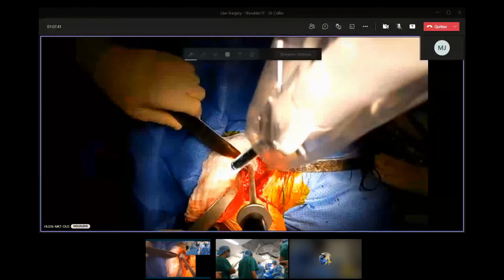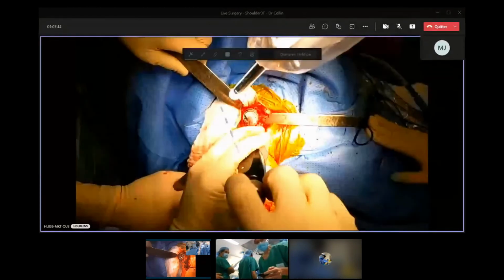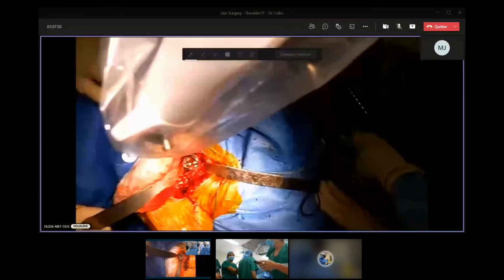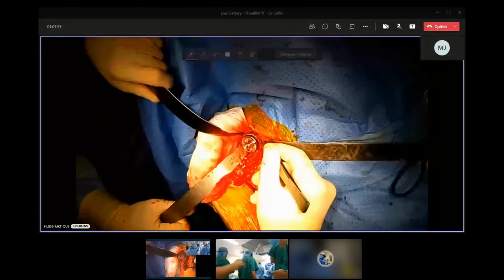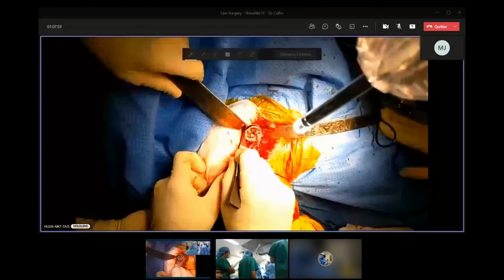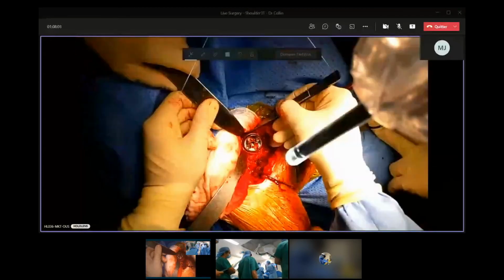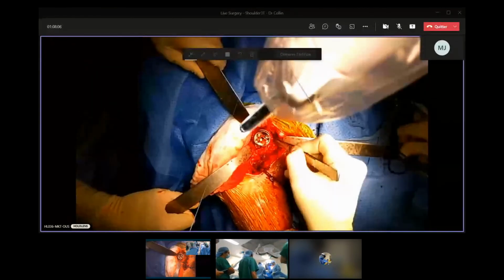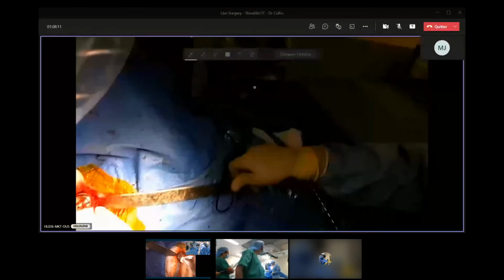Okay. So now if you remove that, you can see that the glenoid is shifted. You have bone here. Posteriorly, you have almost no bone here. Look at here. You have the big graft superior because we wanted to compensate a huge inclination, as you can see here. Okay for you, Philippe? Fantastic. Perfect. Okay. The goal is that. So now, if I want, I can have a look.